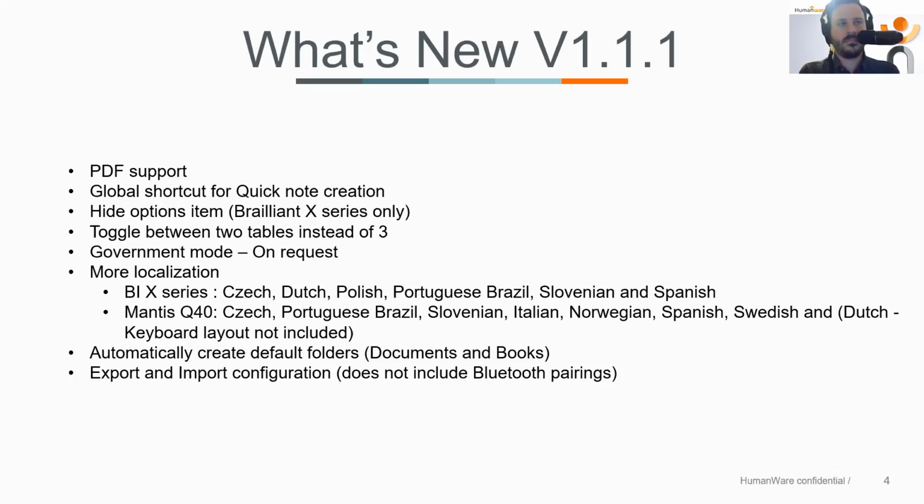We have new folders that we now create. So default folders, documents folder, and book folders. So the location of your editor application will be stored under the documents folder. So these will be created by default.